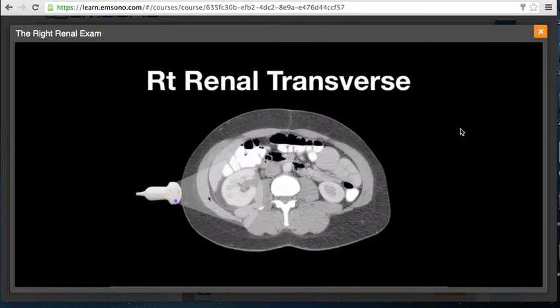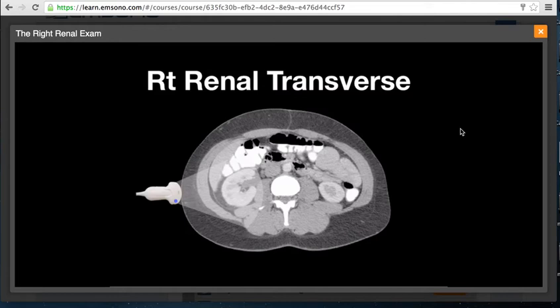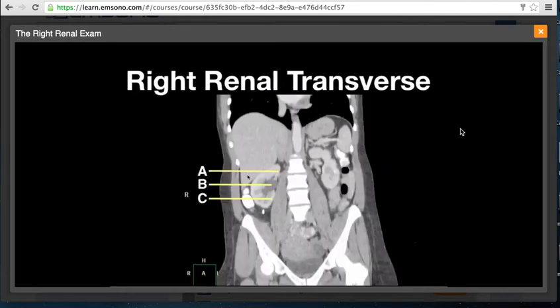To perform the right renal transverse scan, the transducer is rotated 90 degrees counterclockwise so that the indicator is pointed posteriorly. The right kidney is imaged through the renal pelvis in the transverse plane — you cannot be at the superior or inferior pole; you must go through the pelvis, which may require sliding the transducer up or down. Looking at the transverse scan from a coronal perspective, scanning planes A or C will not pick up hydronephrosis; you must be in scanning plane B.